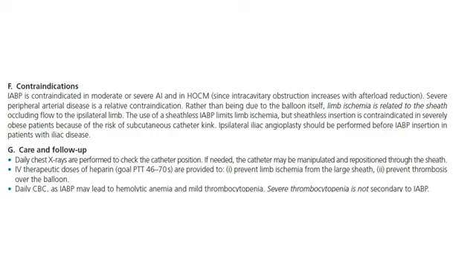So people think if you're 1 to 1, you don't need heparin. That's not true. You still need heparin. It's less mandatory than if you're on 1 to 2 or 1 to 3, but you still need heparin to reduce catheter balloon thrombosis. But even more so, regardless of your balloon augmentation mode, you still need heparin to prevent limb ischemia. One of the big hazards is limb ischemia from the big sheath in the groin that you're leaving for days. So that's why you need to give heparin to those patients. Okay, that's another reason, regardless of your inflation mode.